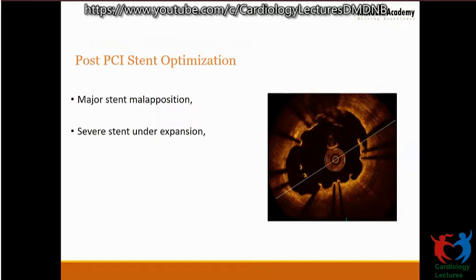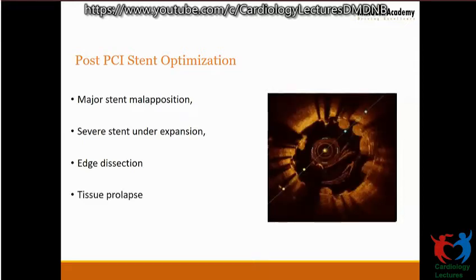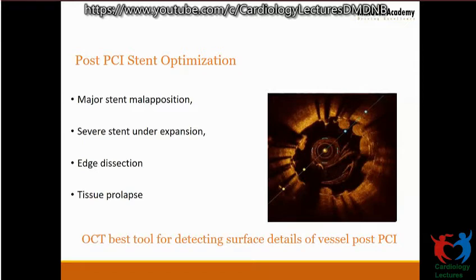Malapposition can occur even in a well-expanded stent or an under-expanded stent. So in case of an edge dissection, you can also have tissue prolapse, where the tissue prolapses through the struts into the lumen. You have grading from grade 1 to 4. In an ACS situation, this is generally thrombotic material, which can be overcome with a slightly larger balloon. In a chronic stable angina patient, if you have a lipidic plaque prolapse, this has been shown in studies to be a predictor of ISR at that site.